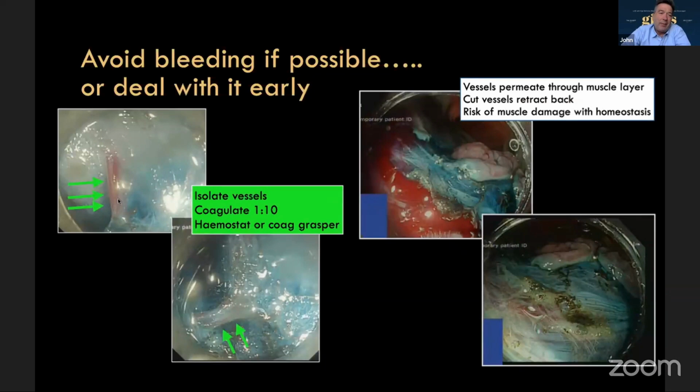We talked about this vessel. So I leave the settings as they are, and I just wait for the delay. I don't change my settings because I've gone into saline. But I've got relatively old settings because I've got an old machine, and you get used to it.